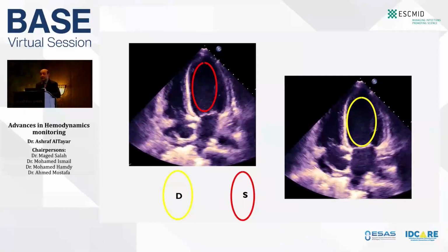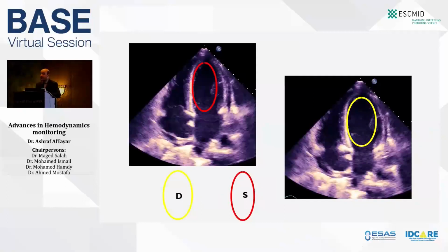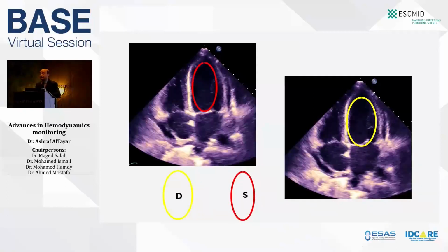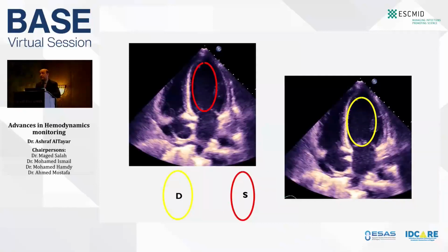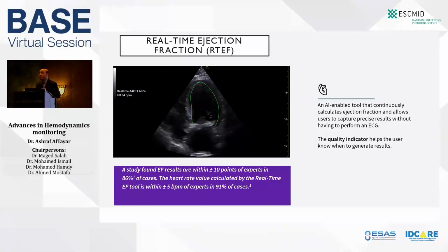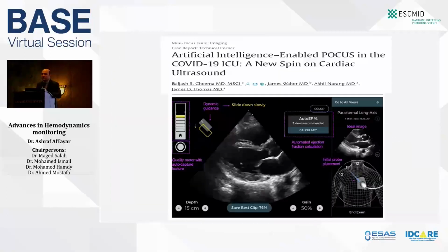Subtracting systole from diastole and dividing by diastole gives you the ejection fraction, with marked improvement in its estimation. This was found to be more accurate than what we do at the bedside, especially in our critically ill patients. But again, you have to give the machine a good image with good delineation of the endocardium. Otherwise, the machine will give you wrong information.